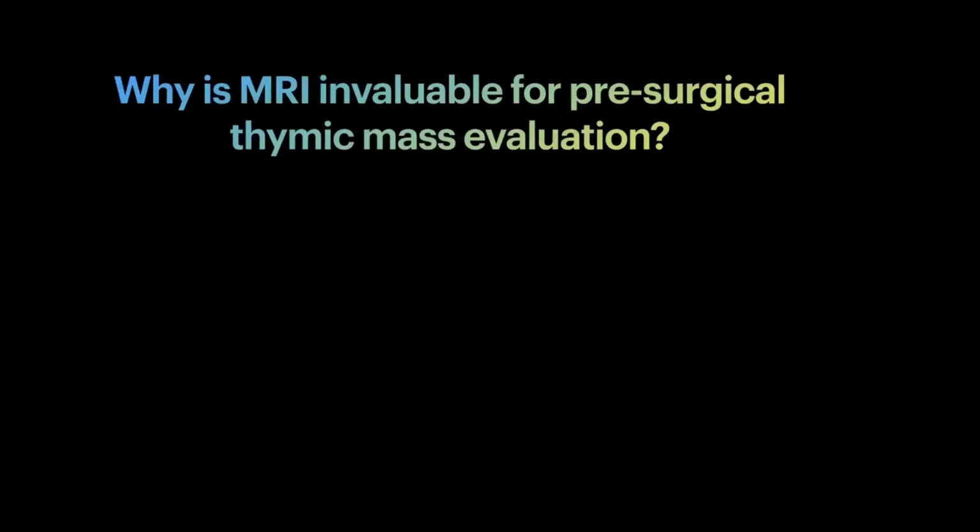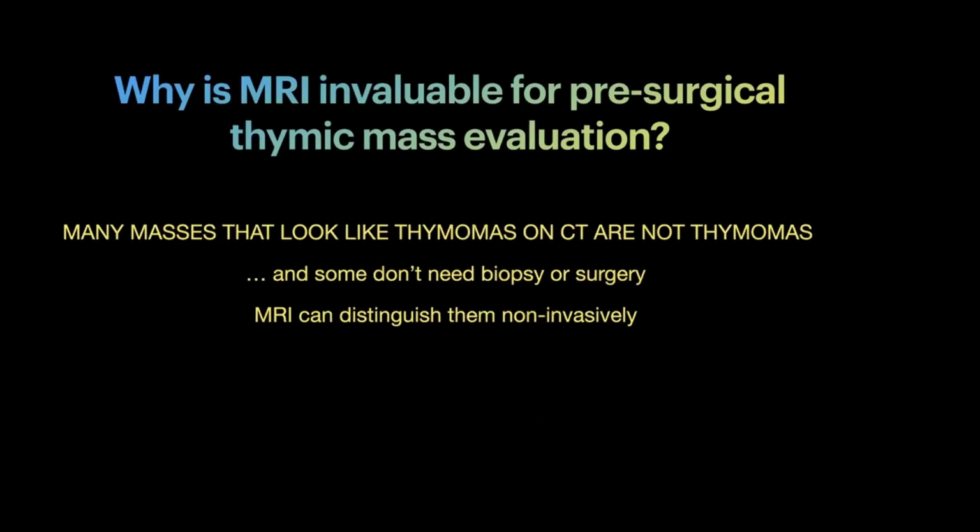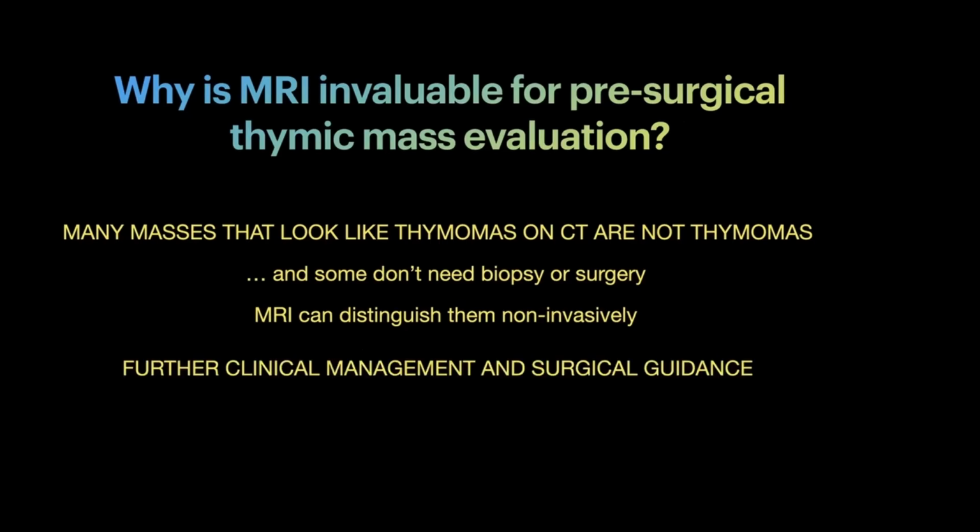and increased thoracic surgeon comfort with patient management in nearly all cases. So why is MR invaluable for pre-surgical thymic mass evaluation? Many masses that look like thymomas on CT are not thymomas, and some don't need a biopsy or surgery. MR can distinguish them non-invasively and also further guide the surgeon when surgery is needed.